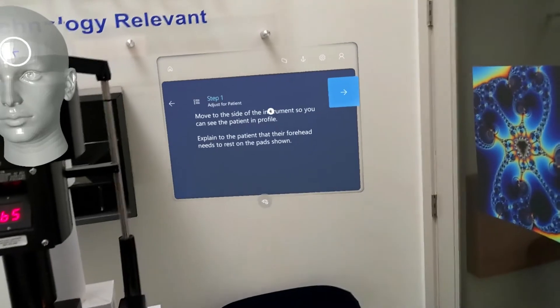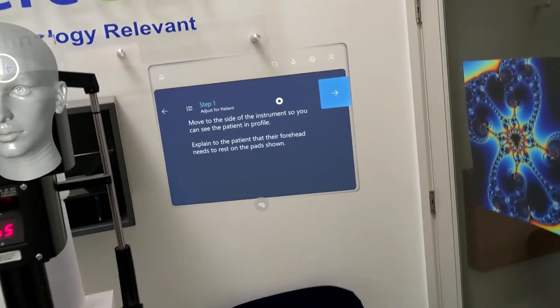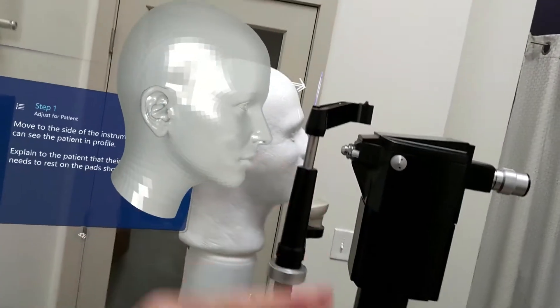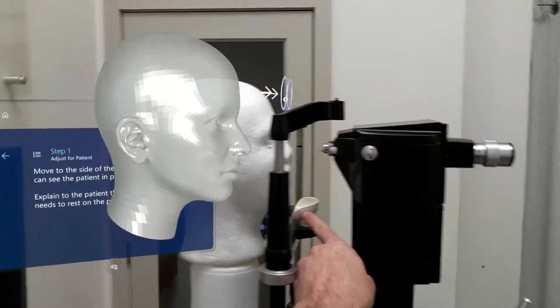Move to the side of the instrument so you can see the patient in profile. Explain to the patient that their forehead needs to rest on the pad shown. Now we have a holographic representation of the patient's head. We should see where their gaze should be going, and we're going to alert them that we want their chin to rest on this cup here.